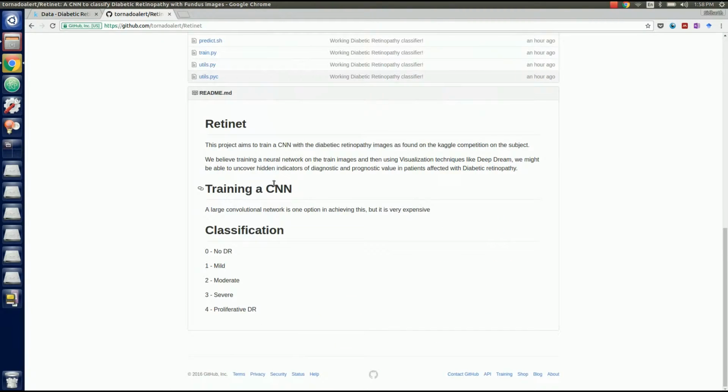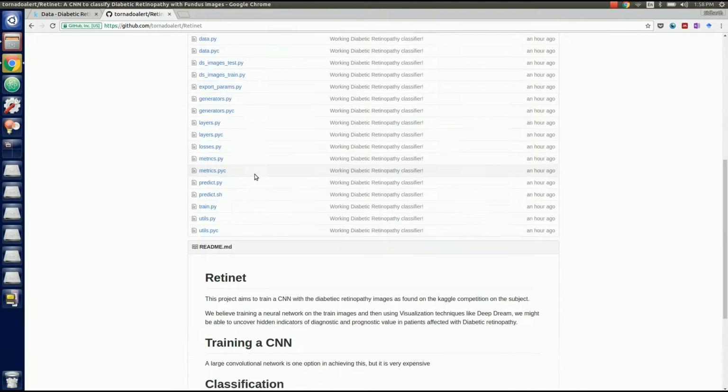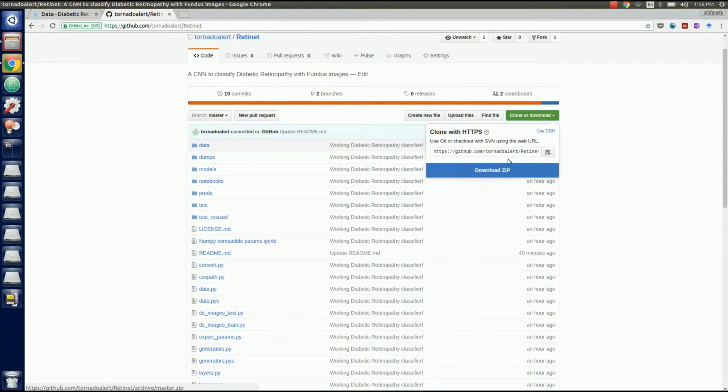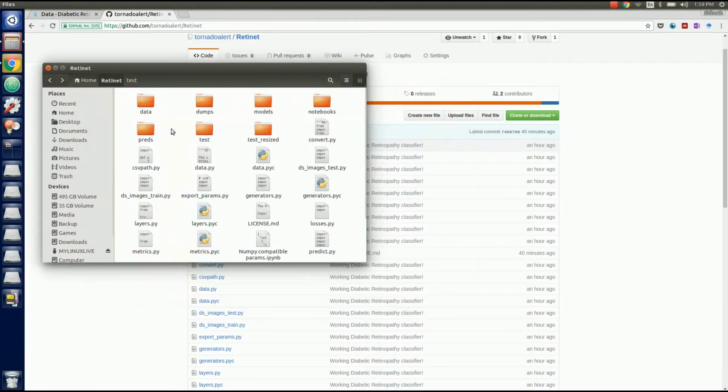So after we've done that, we just put it up on GitHub. It's open source, so you can download this to classify your own images. I'll show you how you can do that. First, download the zip or just clone it using Git, and then have a copy of it in your home directory. So I have mine here.